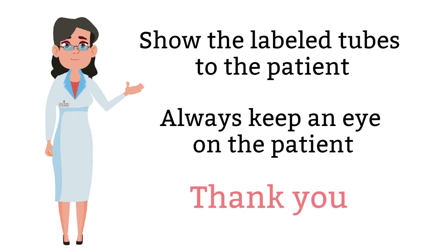Eighteenth, you then thank the patient for his or her cooperation and exit or let the patient go.